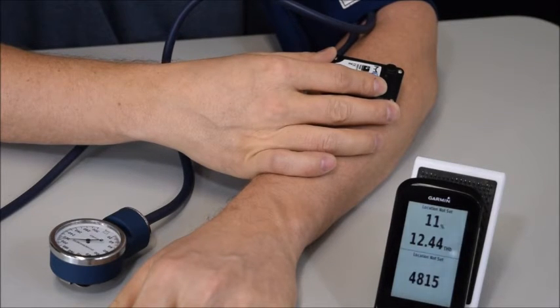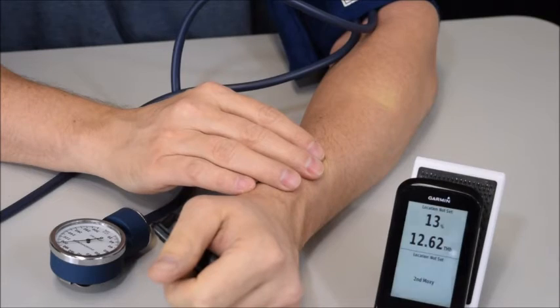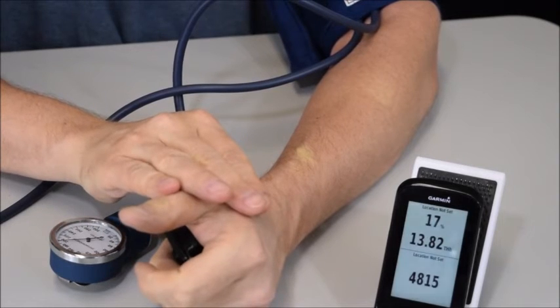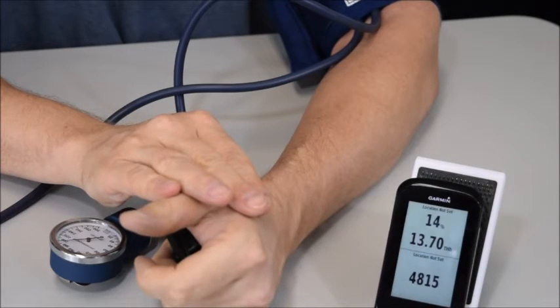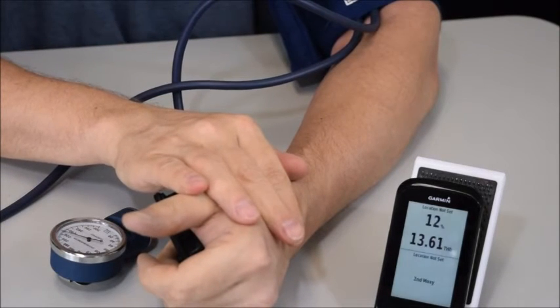And we'll see that this slowly approaches zero. As we get near the bottom, it slows down. So there we're at 9 on the Moxie. 8. And then I'm also looking at the Moxie on the thenar eminence. See where that is. That's showing a little bit higher yet. Depends a little bit on position, I suppose, but a few points. So we're still seeing the thenar eminence trickle down as well. But getting down to those really low values, which is what you would expect because we have this occlusion up over 200 millimeters of mercury.